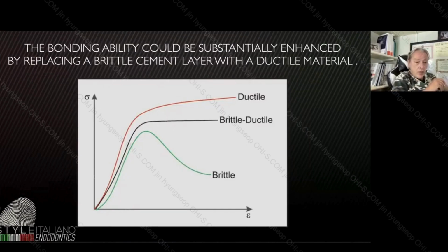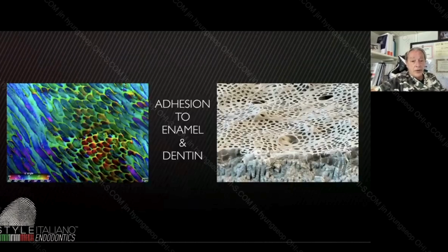And we have one more principle that is not so often cited with adhesion, because I have shown you that we used rigid cements, but now with the advent of adhesion, we use cements that are not so brittle as the cements that we used previously, are ductile, so they can perform much better than before.